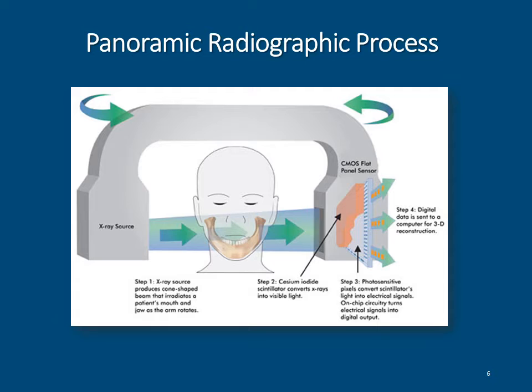As the X-rays are conducted, this machine moves around the head, and again on the opposing side, the X-rays are sending radiographs to the receptor, and it is collected on the plate. And there is where you have an overlapping of anatomy, and you will sometimes see what we call ghost images.